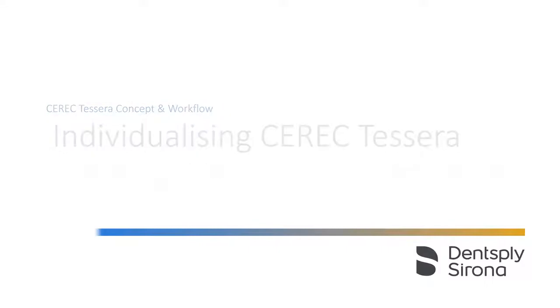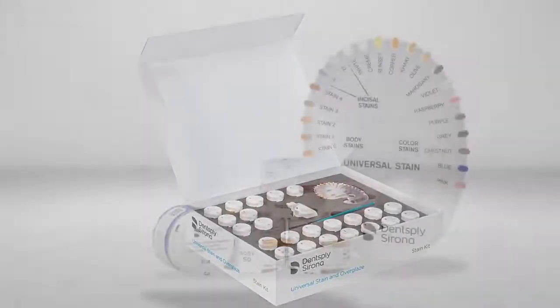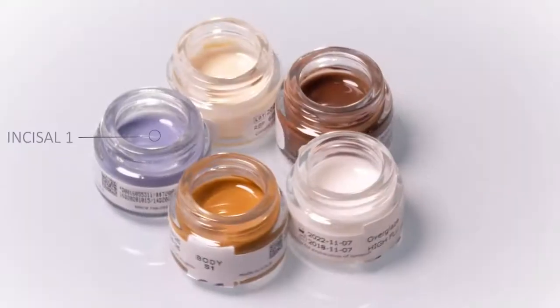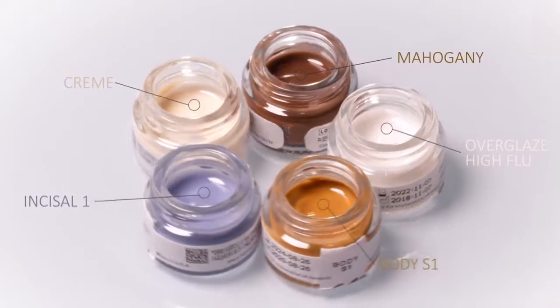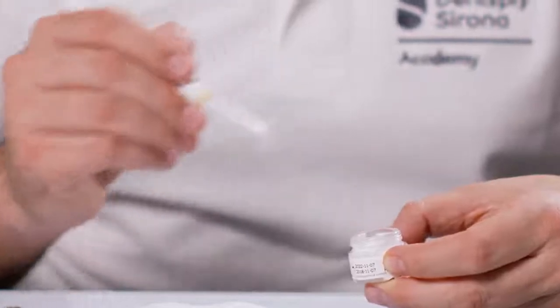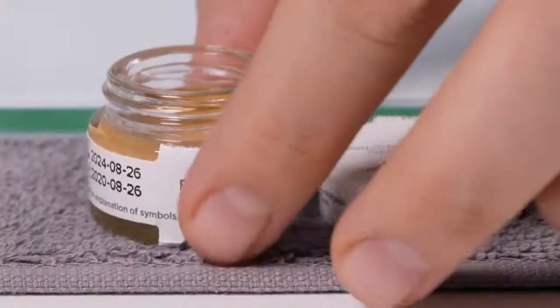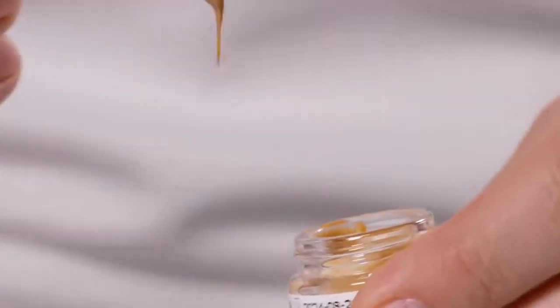For the highest aesthetic demands through individual characterization, 21 stains and two glazes are available in the Dentsply Sirona Universal Stain and Glaze range. With a selection of only four stains and one glaze, Education Specialist Yamen Shaban demonstrates the all-in-one procedure, which is the use of stains and glaze in one firing.